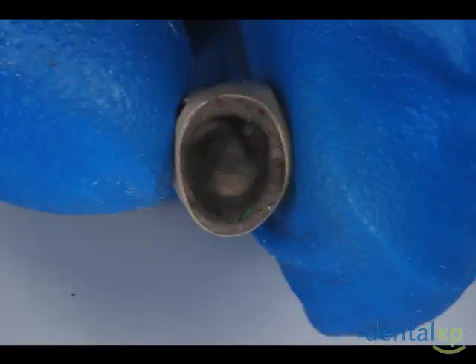A technique will now be presented to show how to reduce gingival excess cement on cemented implant crowns. The gingival sulcus around the implant crown is often more than 3 millimeters deep, allowing cement to harden below the gingival margin. Removing this hardened excess cement is difficult, causing irritation to the tissue. If not completely removed, the excess cement will cause chronic tissue irritation.